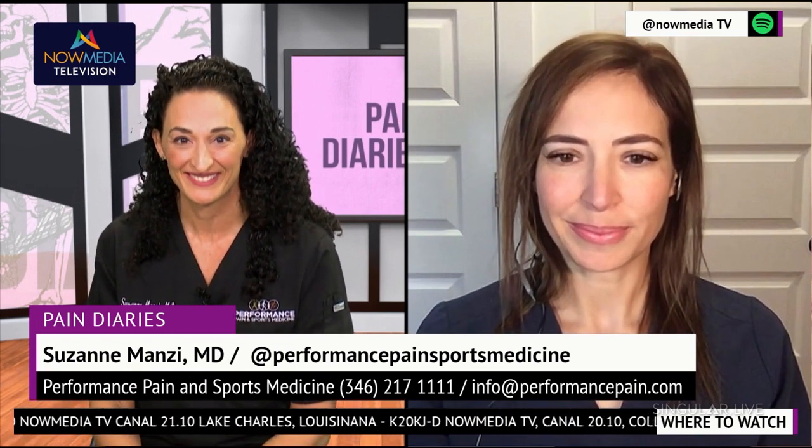But yes, pain relief, functional improvement, and hopefully those signals, and what we've seen in your practice and my practice, it's targeted where you can actually hone in now on the low back. Whereas in the past, it was more just extremities and you're able to get the nerve pain. But really targeting the low back now with different frequencies has been a great addition to this therapy that's been around for, like you said, 50 years or so.